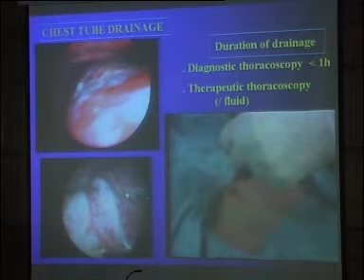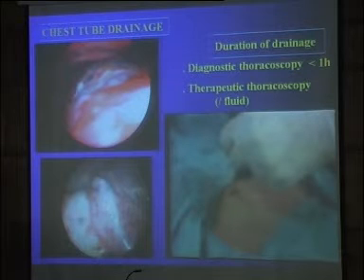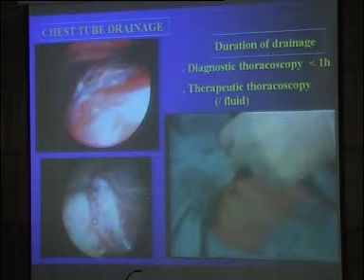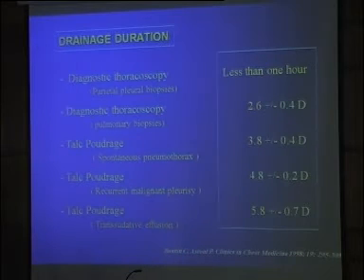I can tell you, it's less symptomatic, and that it's not a big deal. Sometimes, even in case of trapped lung, we go through thoracoscopy to make a diagnosis. We try a symphysis, but the main point is to advise the patient that maybe we get prolonged drainage and also a failure of the symphysis.